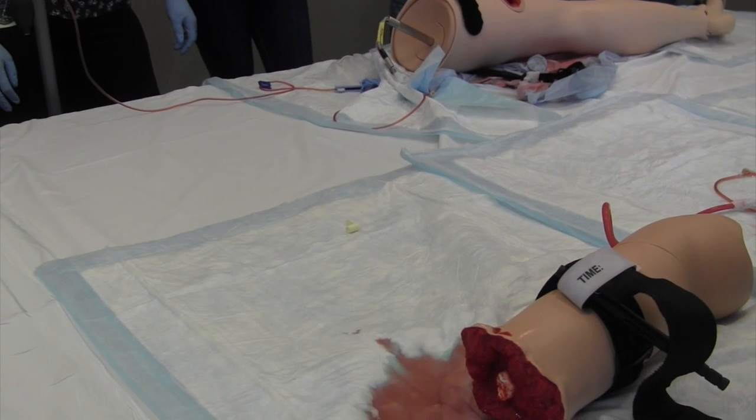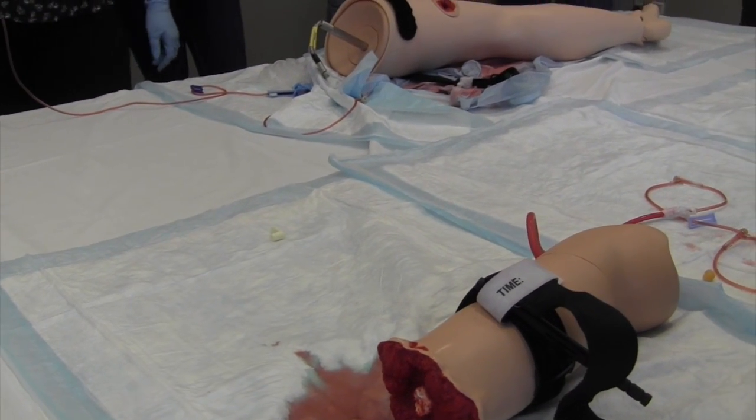Remember also, for a really big wound — let's say like a thigh — you might need two of these.